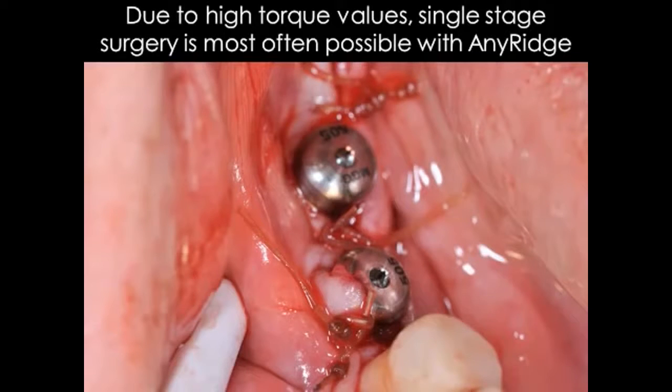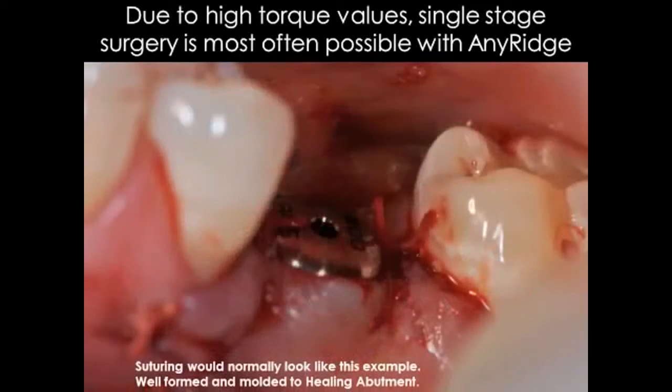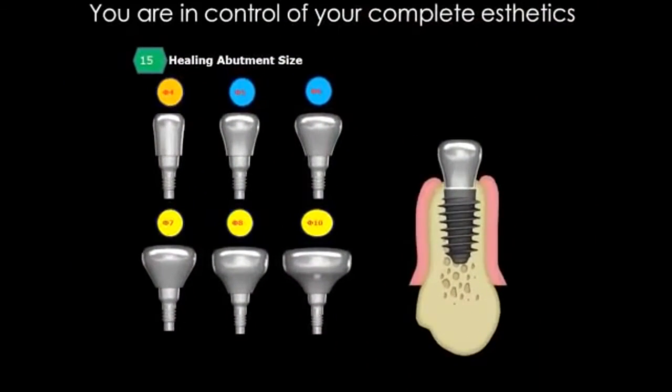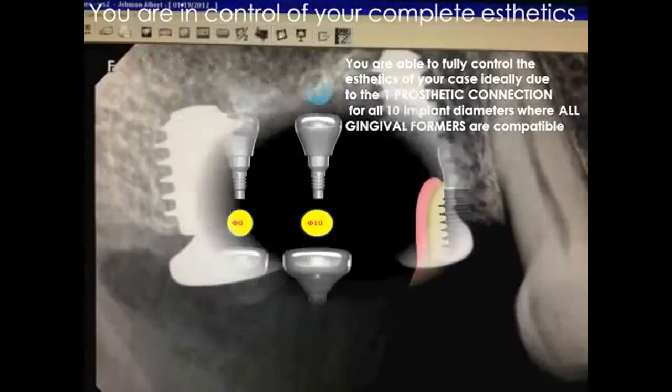Here you note the single stage procedure that's always typically possible with your AnyRidge implant, simply because of the high torque values or high primary stability reached. Now here you see a really nice molded formed what we call gingival former healing abutment in place, really nicely formed around that. Now the very unique thing about your AnyRidge system, again, because it utilizes one prosthetic table or one prosthetic connection, all your different healing abutments are interchangeable. That means you can really control your aesthetics much easier.